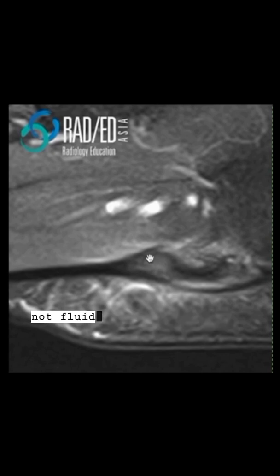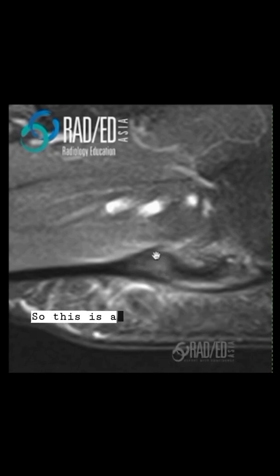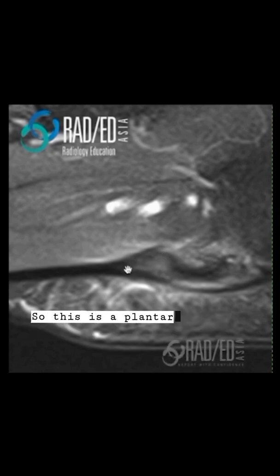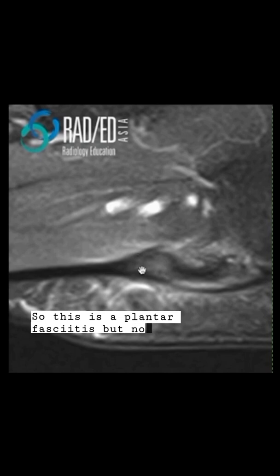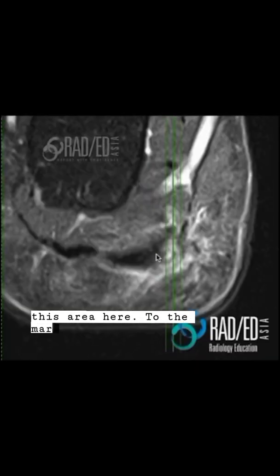This is not fluid signal — it's a lower grade signal than that. So this is plantar fasciitis, but not a tear in this area here.